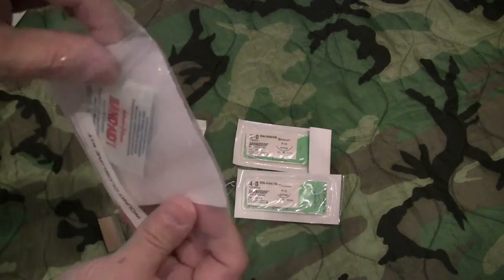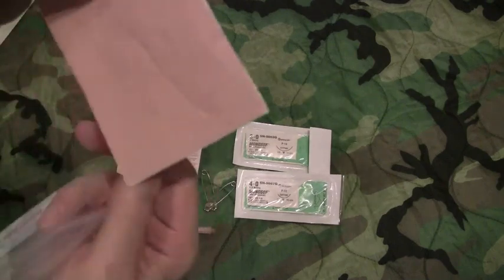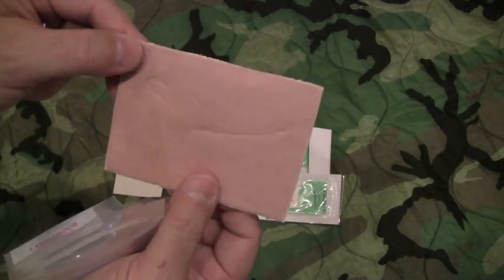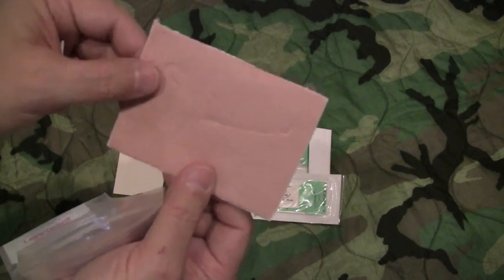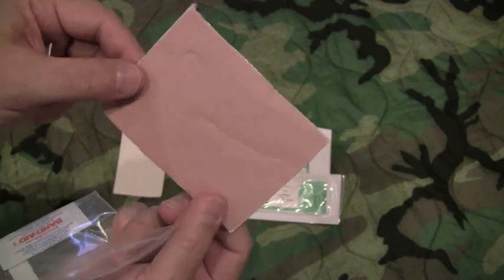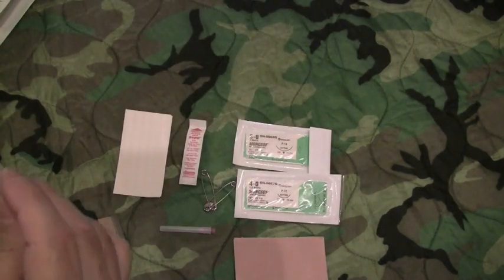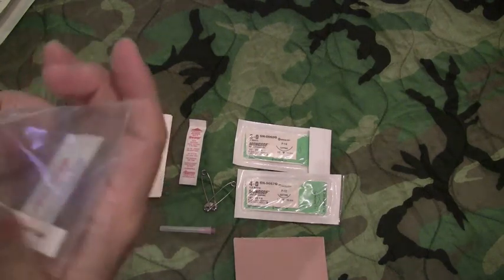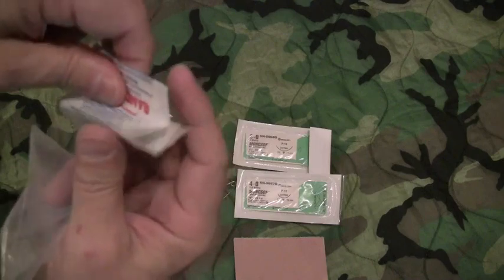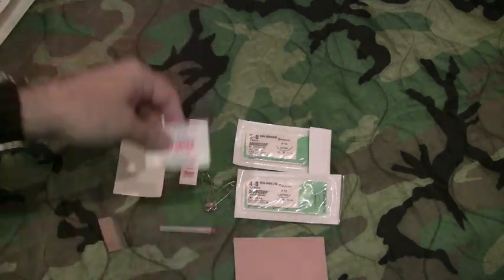And speaking of moleskin, that's in this kit as well. A small piece, but enough to get the job done. And if everybody carries one of these kits, you have a multiplier effect, and so you've got a lot of capability and depth. Piece of moleskin. And this is something new, but I've decided to add these 4 small butterfly dressings.